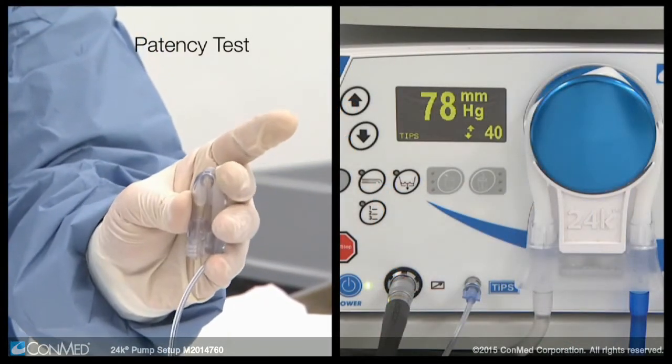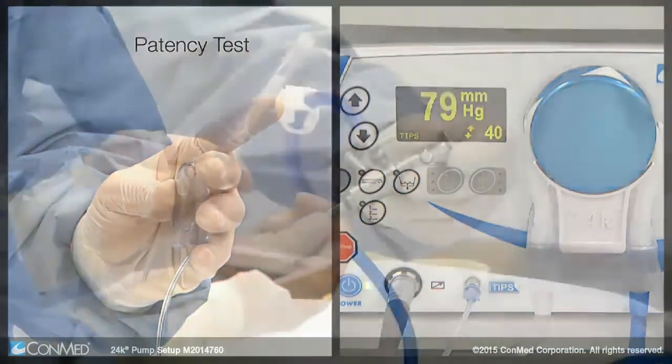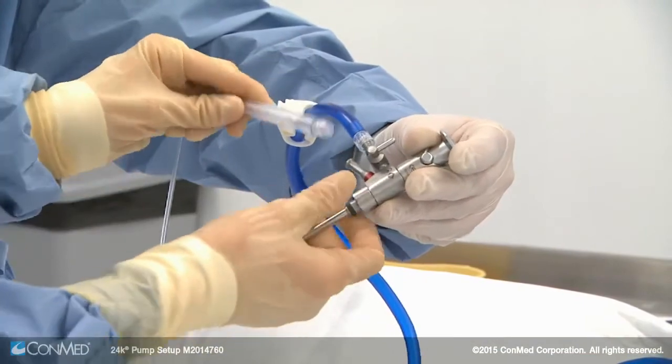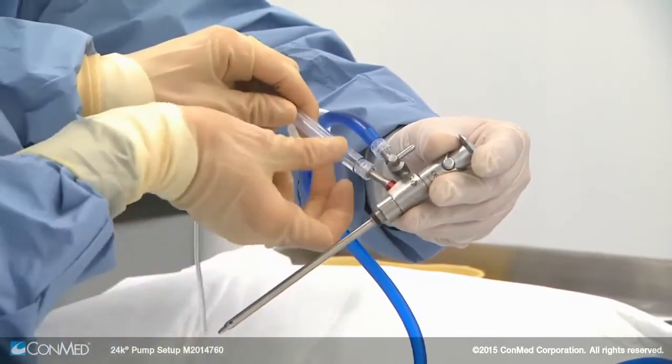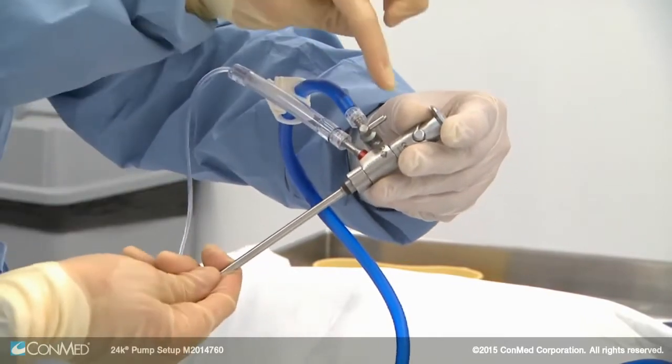Fold the balloon and hold it — the pump display should show the pressure increase and then stay steady as you hold. Now the balloon end of the TIPS line can be installed to the pressure port on the scope sheath; simply twist in until snug. Open the inflow lever and you're ready.